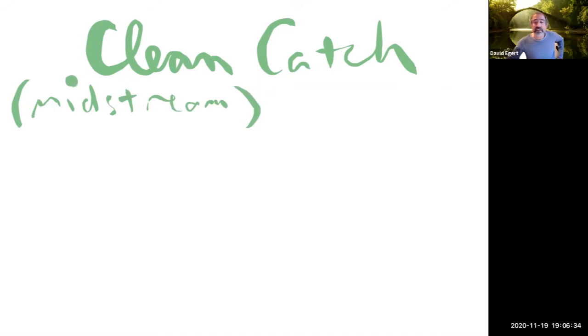The basic idea here is that when you start peeing, there could be all sorts of contaminants on the entrance to your urethra. So what you want to do is start the flow, assuming that that's going to kind of clean things out.